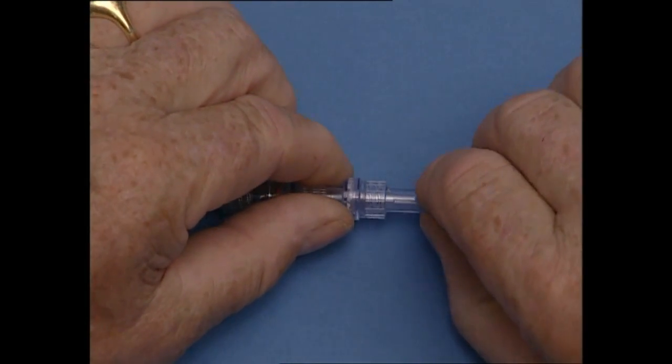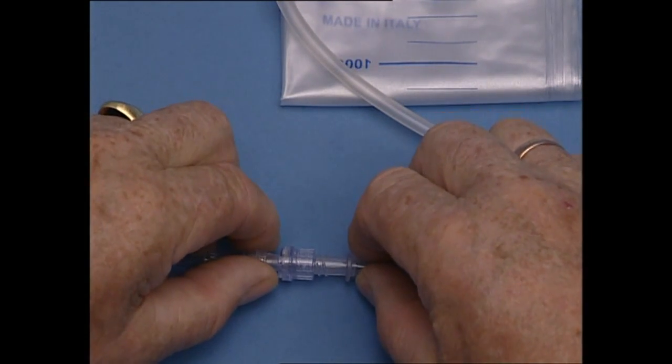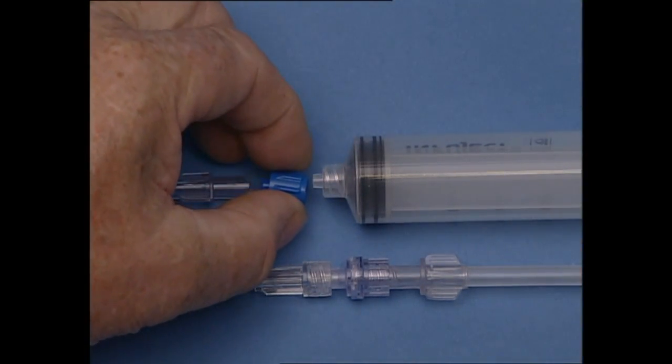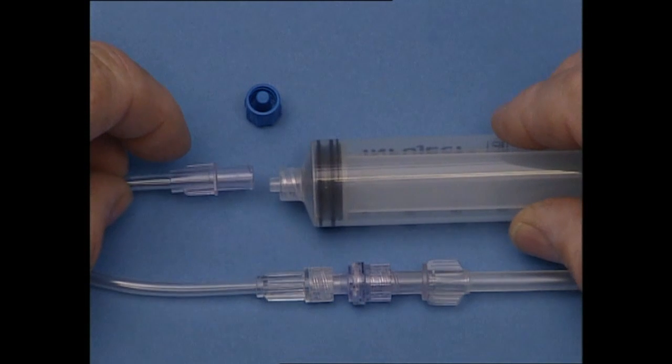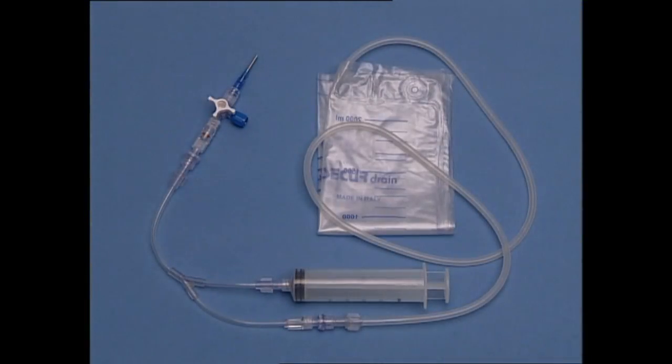First, connect the one-way valve of the slip-on fixture to the luer connector of the Y non-return valve unit. Then connect the one-way valve of the Y non-return valve unit with the secretion bag tube. Once the plug has been removed from the other opening of the Y non-return valve, connect the aspiration syringe. Open the three-way stopcock to allow secreted fluid to be pumped or drawn into the bag. If you want to use the system for installation, aspiration, or to flush the whole system, connect the syringe to the lateral connector of the three-way stopcock. The two other connectors have non-return valves that prevent any flow in the system towards the catheter.